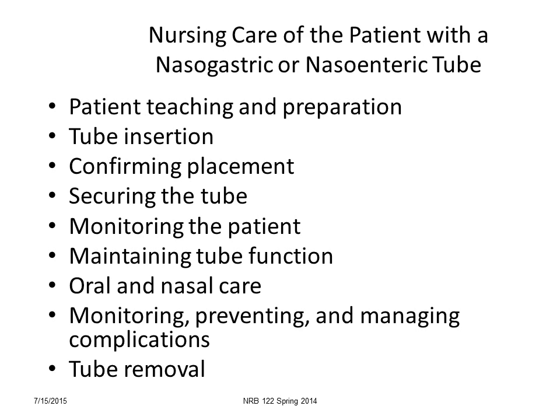So we want to do some patient teaching. We want to explain to them why it's being used. We want to do the tube insertion based upon the policies and procedures of the institution that we're working at, and based upon evidence-based practice. We want to confirm placement by an x-ray. We want to secure the tube. Typically tape is fine, but there's also securement devices that many places use. And then we want to do monitoring of the patient at least every 4 hours, if not more often.